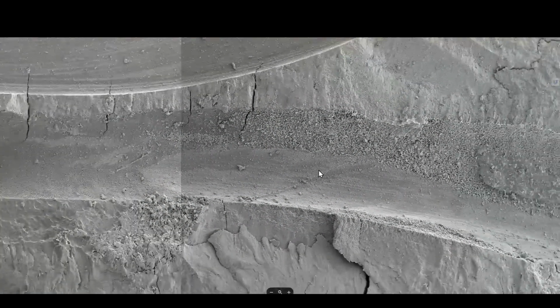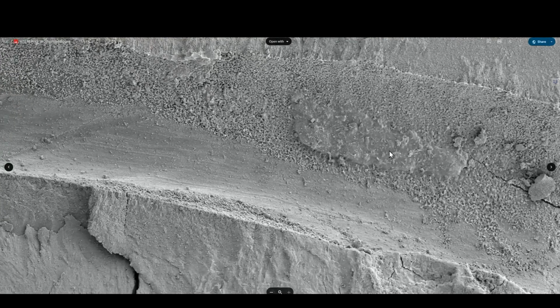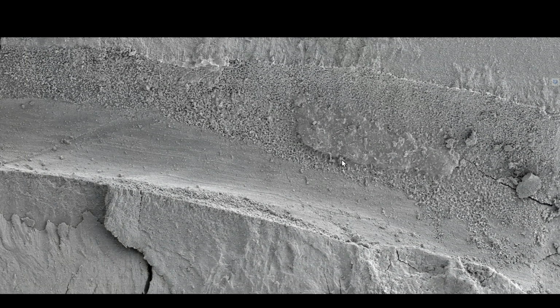And here you can see some predentin. We'll look at it more carefully later. Here you can see a smear layer that has not been demineralized by the device, as well as some further predentin that has not been demineralized.